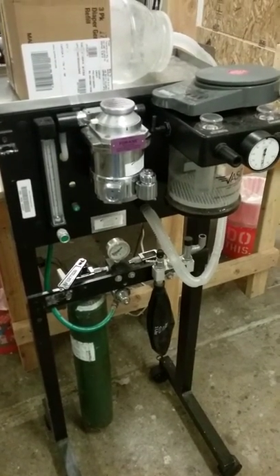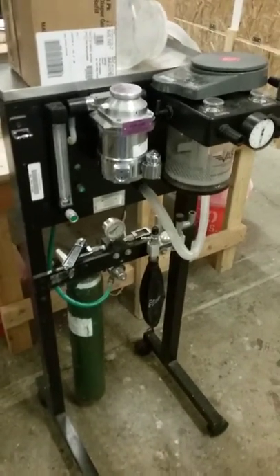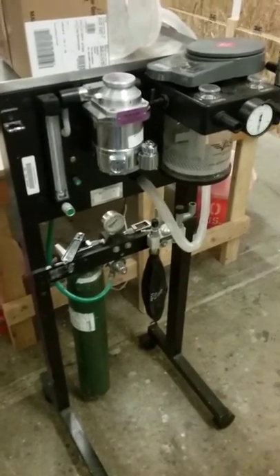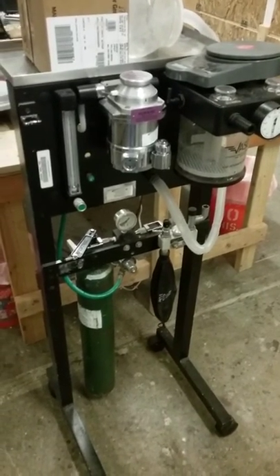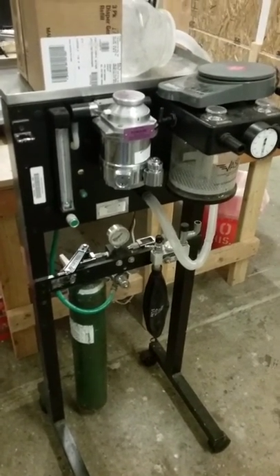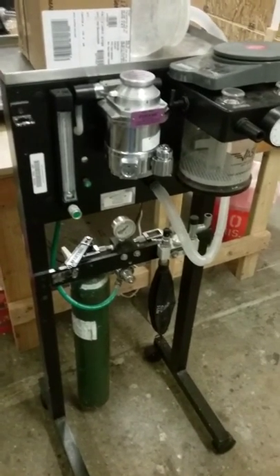All right team, a quick review of how to use the isoflurane anesthesia machine — how to turn it on, how to turn it off, how to change the oxygen cylinder, and how to fill the vaporizer.